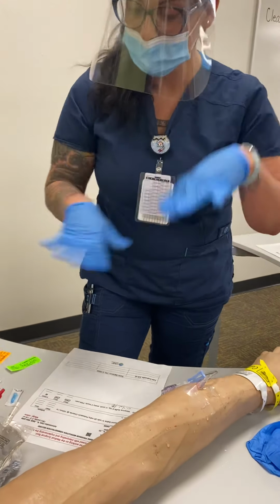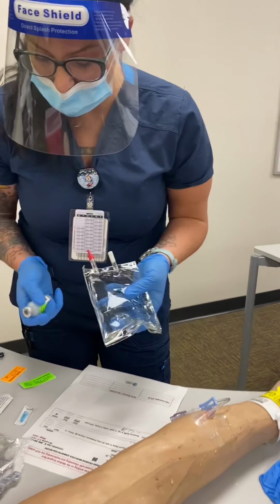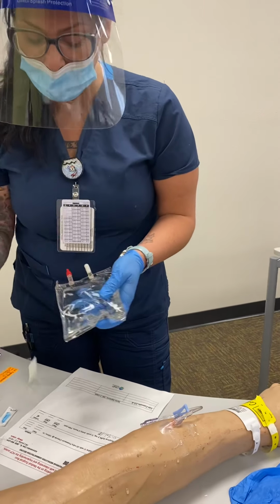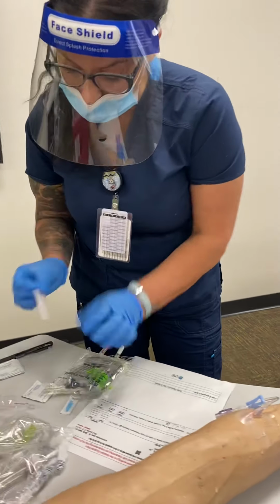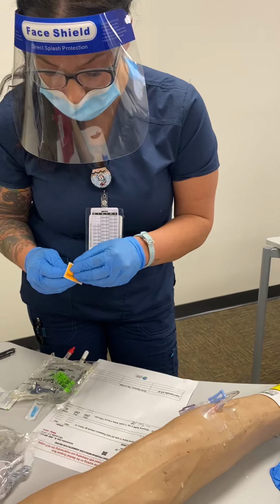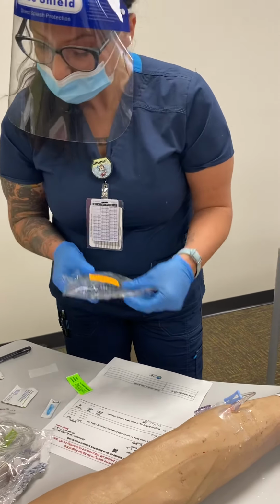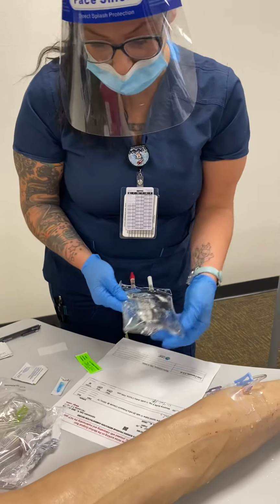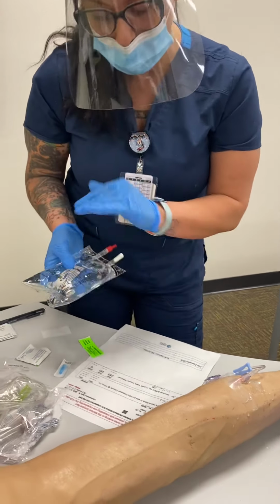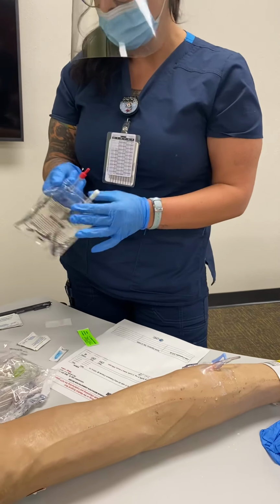She's kind of settling down now, so I can go ahead and get my bag ready. I'm going to do my second med check for my potassium. I had applied a label in the med room to this. I forgot to mention that. So here's my medication label on that bag. And that's how you do your third med check. So I would compare that to my MAR. Everything is good, is the right amount. I know it needs to infuse at 125 mils per hour. So that's going to be an infusion time of 2 hours.